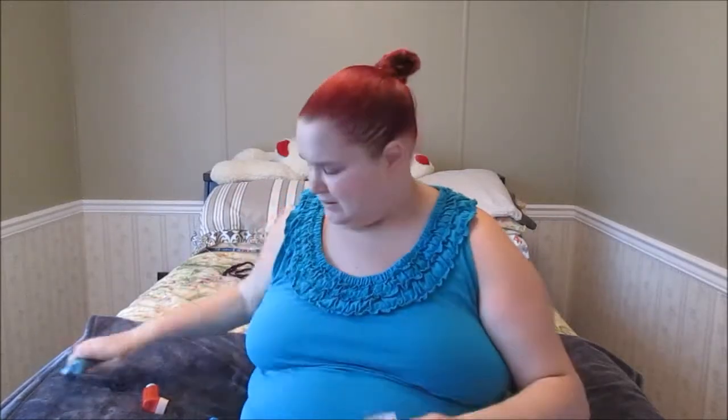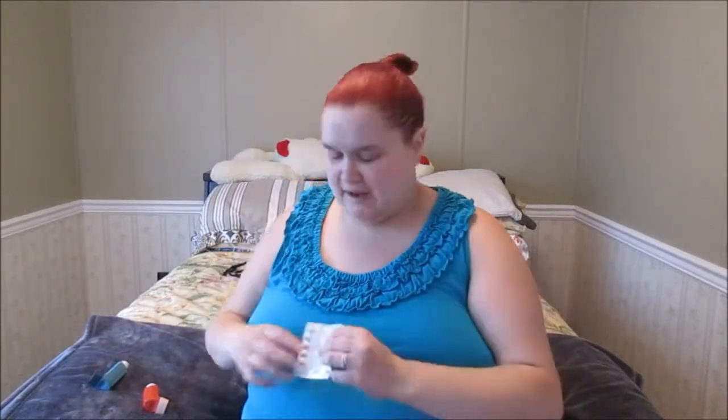Hello everybody and welcome back to Sarah's Life. On today's video I'm actually going to show you guys my asthma and allergy routine. I am on puffers and I'm also on Reactine, and I wanted to show you guys how to take things apart and how to clean it and stuff like that.